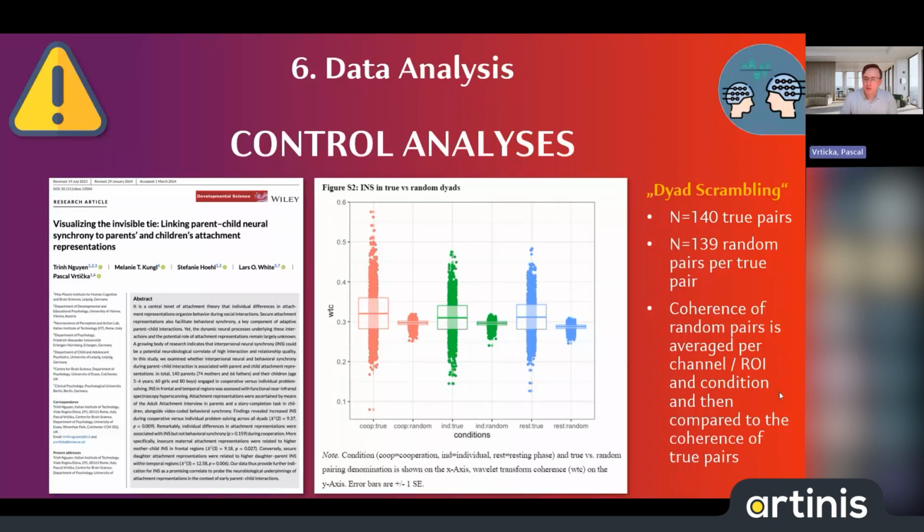We actually recommend doing this not only if we don't have a viable control condition, but also if we have a good active control condition, because it is a really, really nice additional insurance that we don't have spurious correlations in the data that we actually see as being driven by, for example, two people co-creating something or mutually predicting each other.